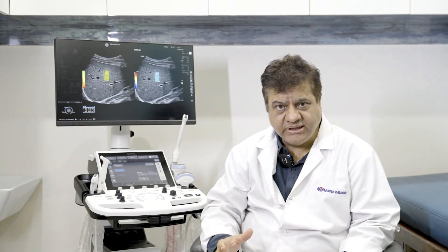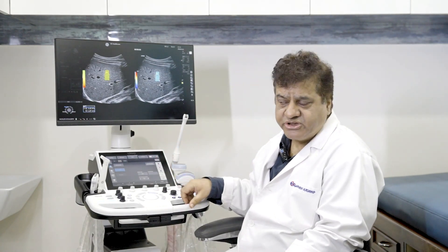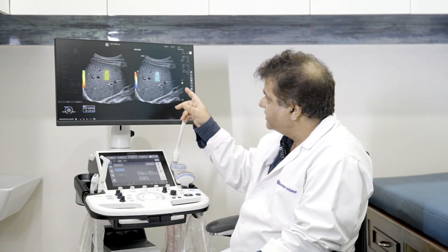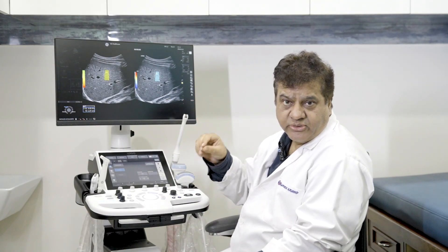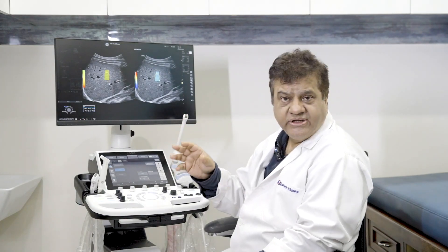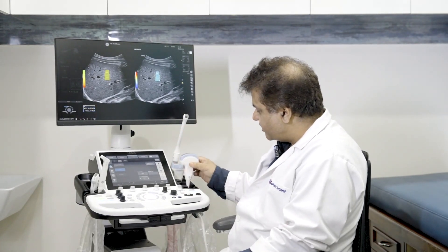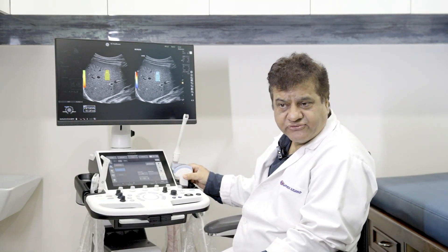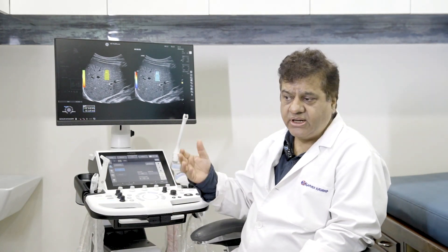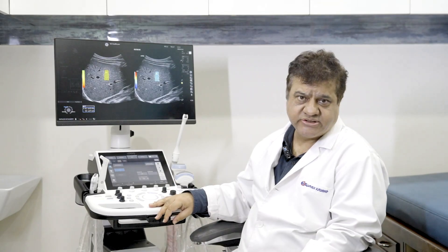This machine also comes with a cardiac package. For patients where you want to measure liver stiffness or detect early cirrhosis, you can perform 2D shear wave elastography. A quality indicator tells you whether the sample site for the 2D shear wave measurement is correct, which is important because an incorrect sample produces inaccurate readings. Using the premium C1-5 probe, you can do liver elastography, and with smaller probes you can also perform elastography of the breast or thyroid.